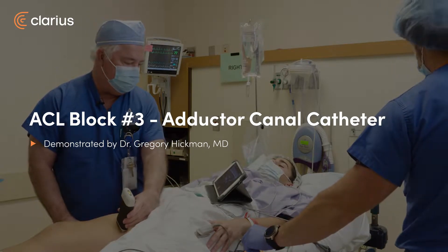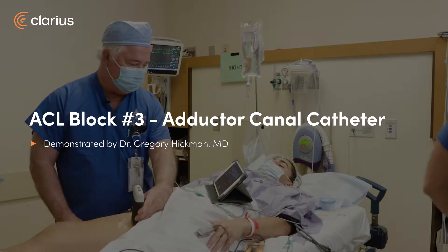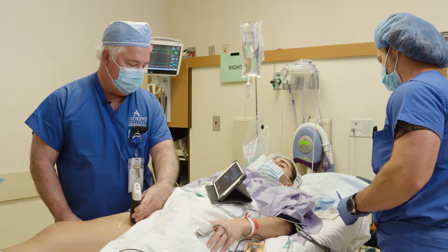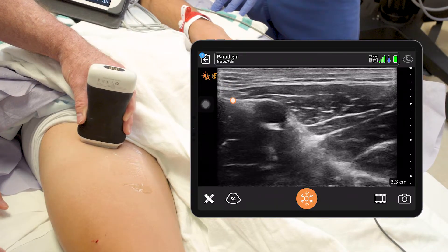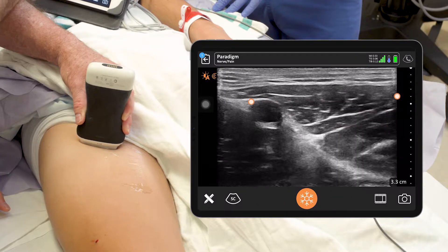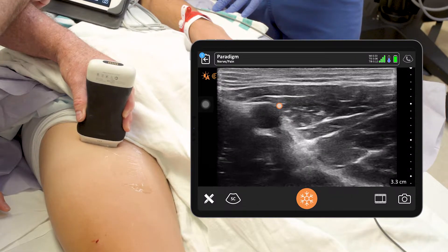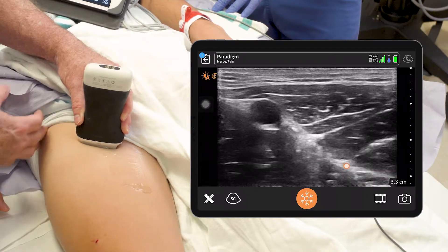So I used to do about mid-thigh, but now I've come a little bit higher, getting a little more proximal. You can see the sartorius muscle — he's got a nice-sized sartorius. The femoral artery is here on the left, the vein is just deep to the artery, and we just want to pop through the adductor canal fascia there.